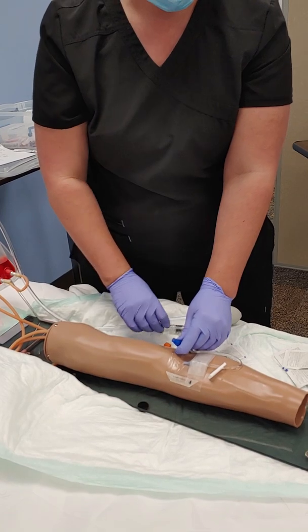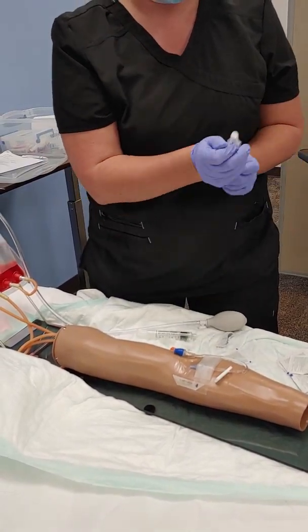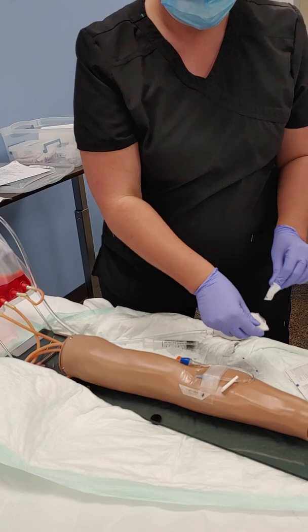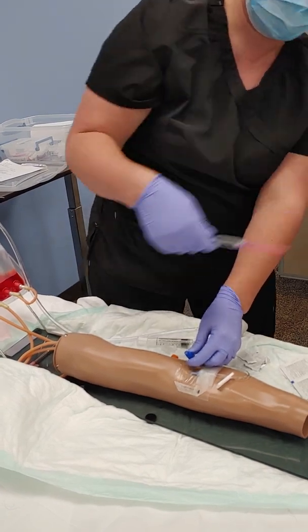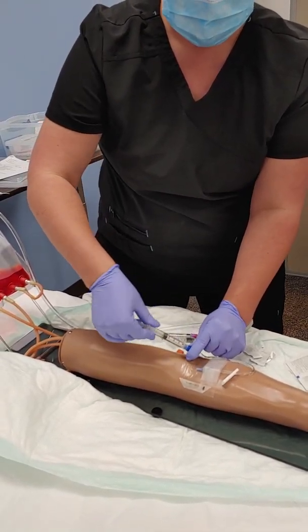So now I'm done with this syringe. Wipe end cap with alcohol pad. Uncap medication syringe. Insert medication syringe into IV. Okay, so now I'm going to clean it again. And I'm going to go ahead and say, okay, Miss Martha, now I'm going to go ahead and push your medication.